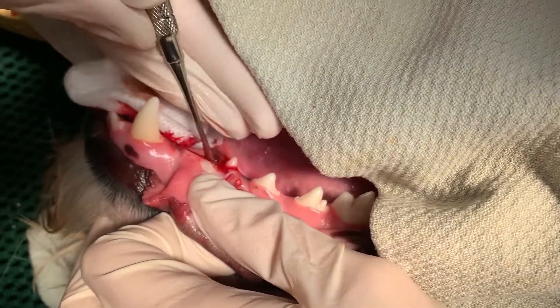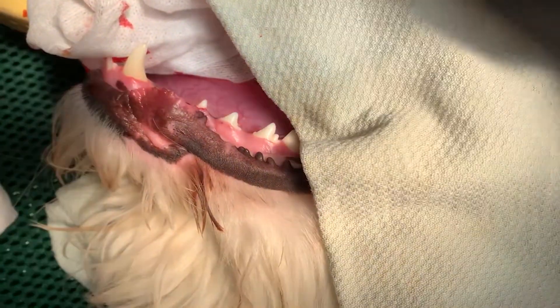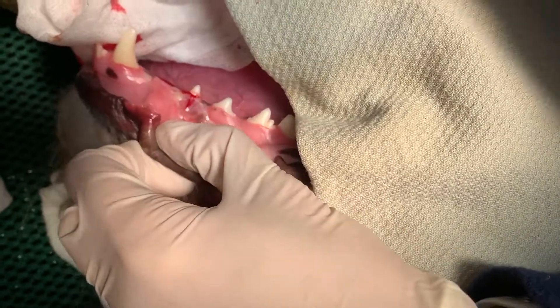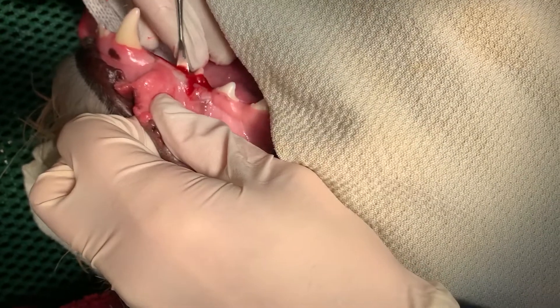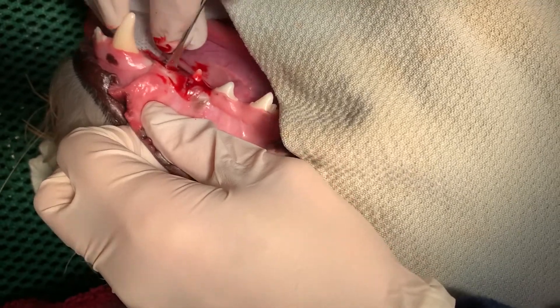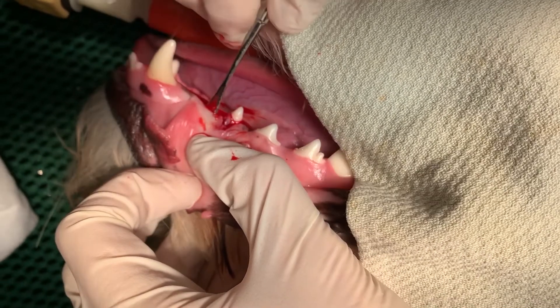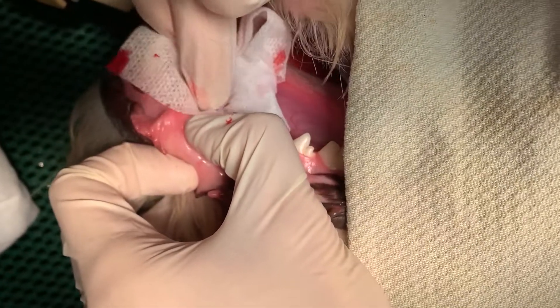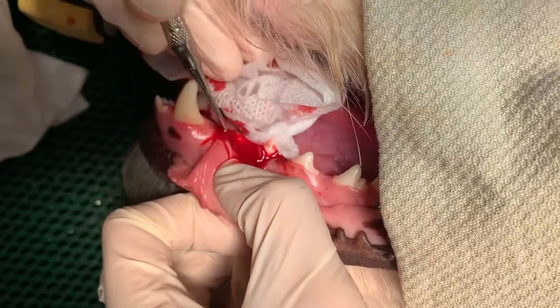Sometimes this is a little bit more difficult to peel away. This is certainly a young, healthy dog. Grabbing a scalpel can help if the periosteal elevator isn't getting the job done. The periosteal elevator is just really kind of falling into place, and the tooth is right there — that's actually the problem. The unerupted tooth is sitting just below the gingiva, so we'll go ahead and remove that and follow the draining tract back.